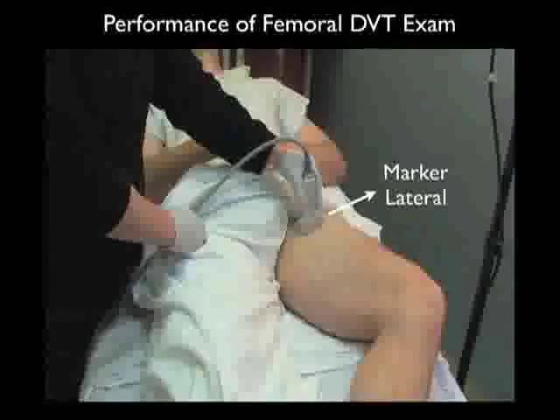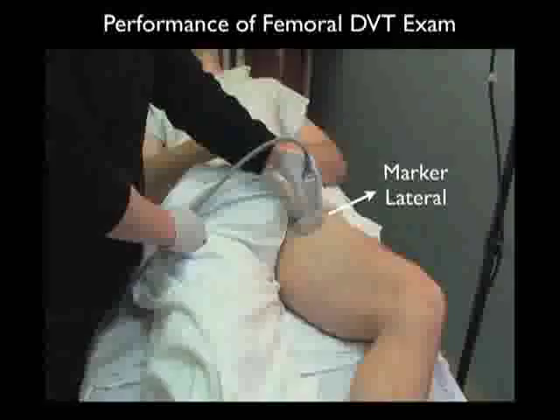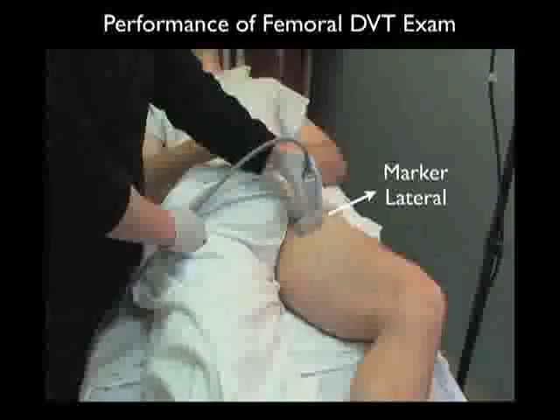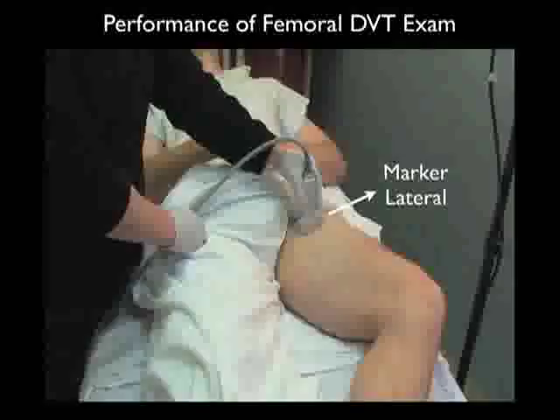It's best to position the patient slightly upright to distend the femoral vessels for the DVT exam. In this video, we had the patient with the head of the bed up about 30 degrees. We also want the legs slightly externally rotated to best orient so that we can place the probe directly over the common femoral artery and vein.